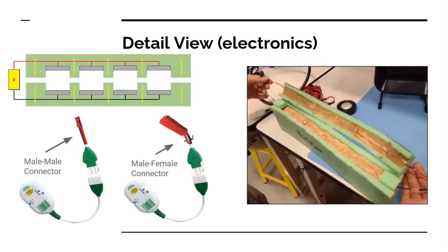This is a diagram of the electrical components of our MagCare system. We have two conductive plates on either side of the foam cavity, one towards the top of the foam block and the one at the bottom. The foam not only prevents the plates from touching before pressure is applied, but it also provides a soft material that blends with the mattress, preventing deformation and improving comfort. When a patient attempts to get out of bed, the patient's legs will put pressure on the device, which completes the circuit. Once the circuit is complete, this will then send a signal to the caregivers to provide assistance to the patient.